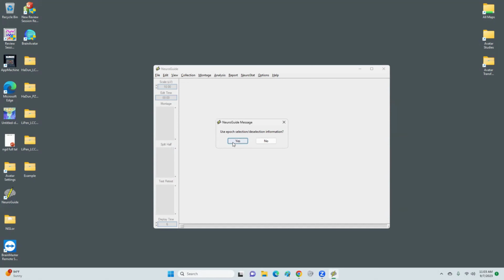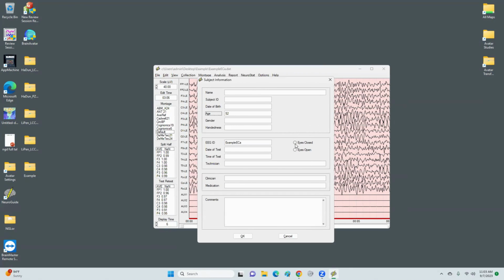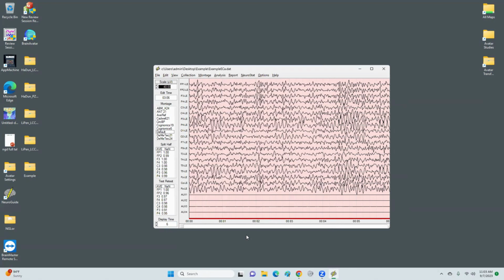We're going to choose yes. For this, we do not need to put anything but the age. And in this case, this client is 52. We're going to choose eyes closed, and then okay. The next thing that we're going to do is start our symptoms checklist.